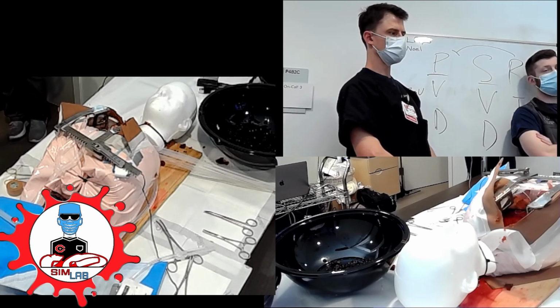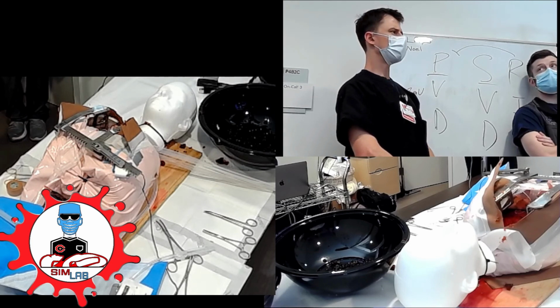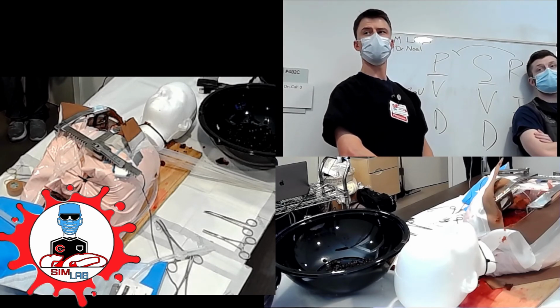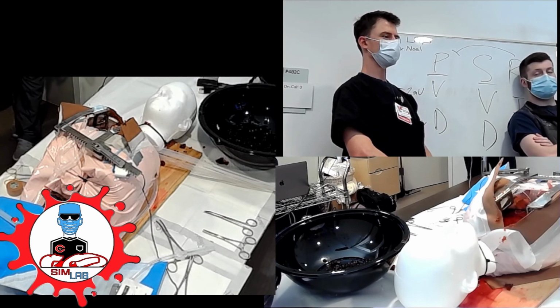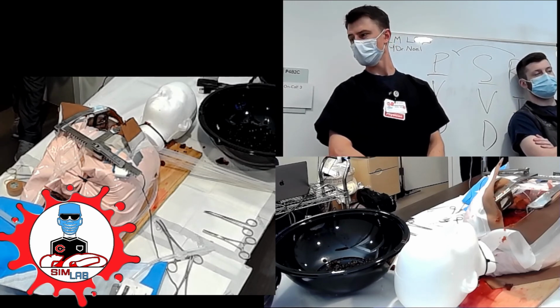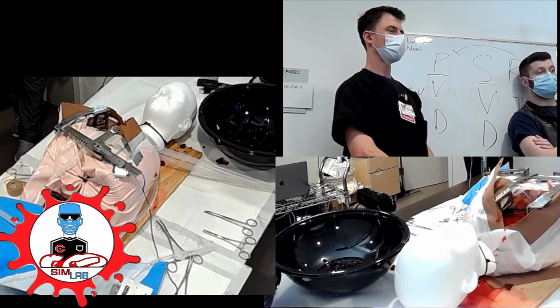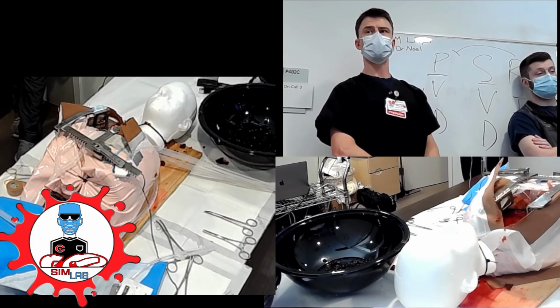And I'm not gonna lie, of all, prevention is the best intervention, right? So, you guys all should know how to strip chest tubes. If you don't know how to strip a chest tube effectively, because it is a skill, number one, don't pull it out. Number two, actually create enough negative suction to strip a chest tube with clot. Because when they don't have medical causes of bleeding, they're going to develop clot in their tube, right? Adisa will teach, she's the one who taught me how to strip a tube. She'll teach you how to strip a tube.